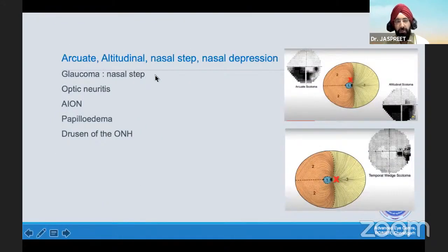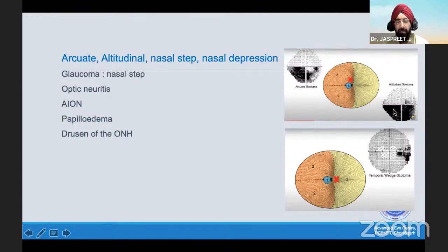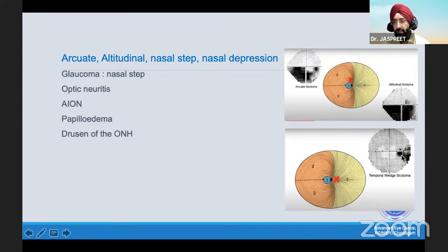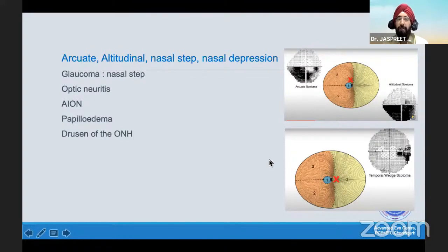Coming on to arcuate or altitudinal scotomas and the nasal step: as you see in so many glaucoma patients, the arcuate scotoma is a common finding. You also have inferior altitudinal field defects seen in ischemic neuropathies — this is because of the superior arcuate fibers above the disc being involved, leading to inferior altitudinal field defects. Anterior ischemic optic neuropathy is one of the most common causes of an altitudinal field defect. You could have it in papilledema, optic neuritis can give rise to just any kind of field defect, or you could have drusen of the optic nerve head. One interesting finding is the temporal wedge scotoma, sometimes seen in a congenital dysplastic optic disc where the nasal fibers are defective. The pattern of visual field defect is very important in localizing lesions, especially post-chiasmatically.